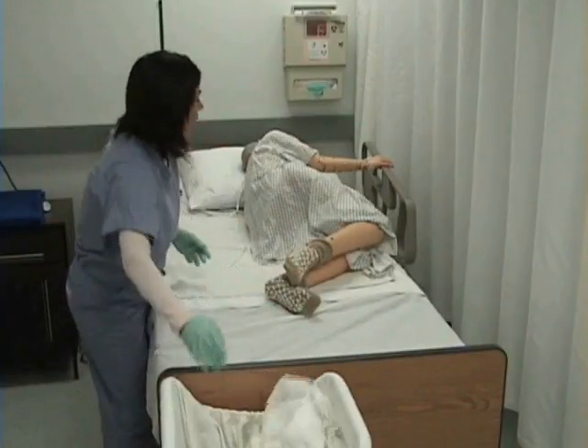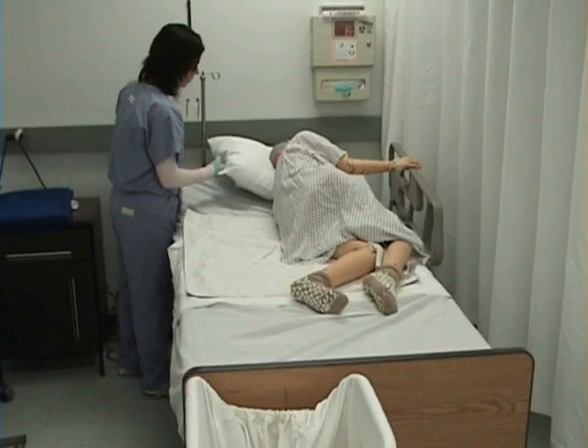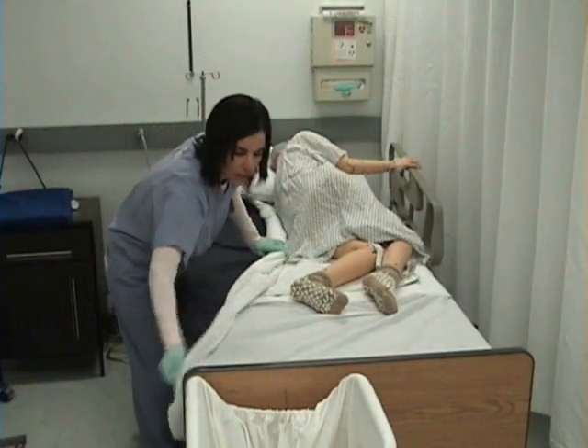As I'm doing this, I want to make sure that my patient is tolerating lying on their side. Now I will loosen the bottom linens and I'm going to be rolling them towards my patient.